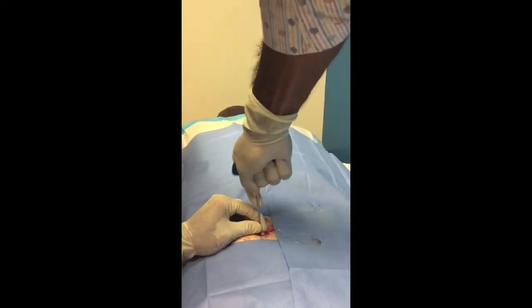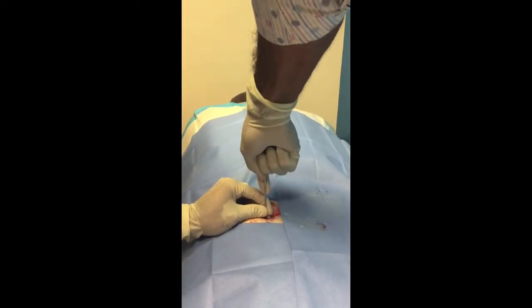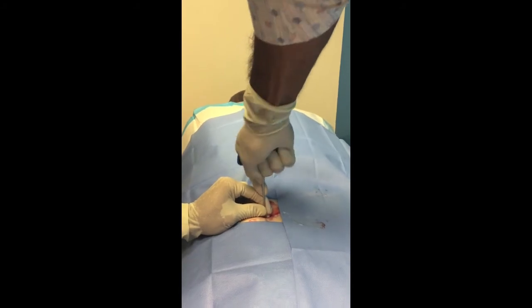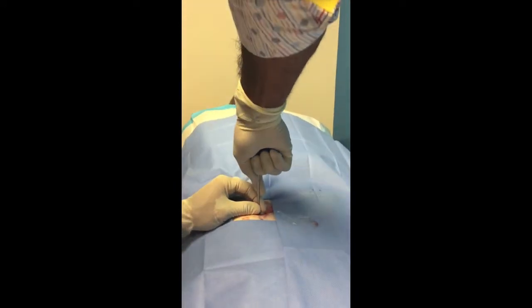Those marks are a centimeter each on the track? Yeah, that's what I'm kind of checking, yeah. Okay. So you're going down? I'm doing about two. It takes about two. Okay. How are you doing, sir? I'm doing okay.